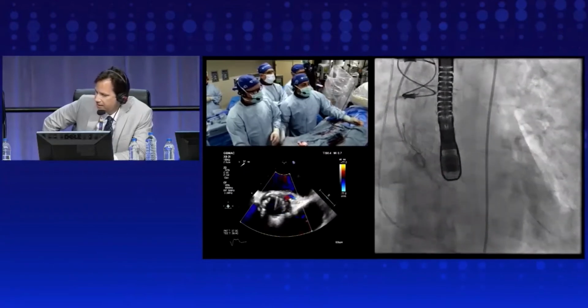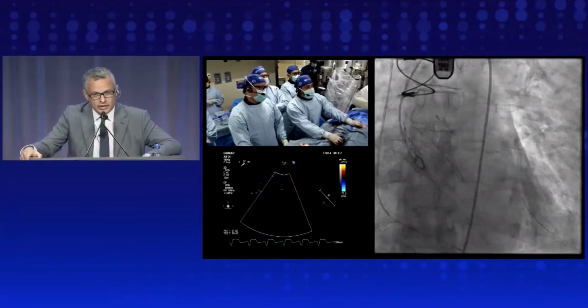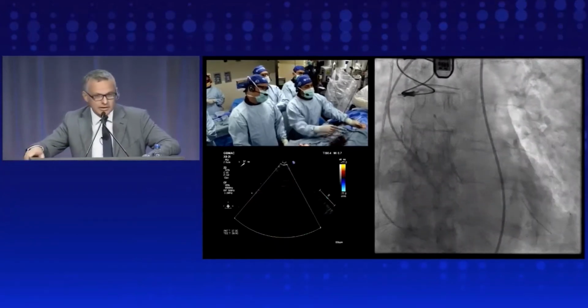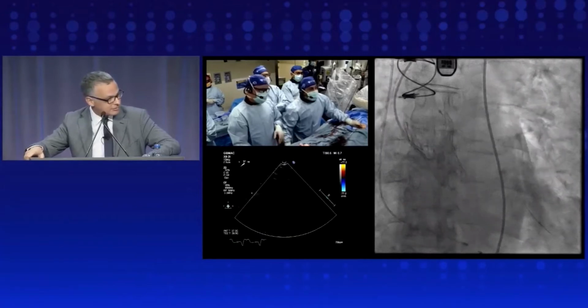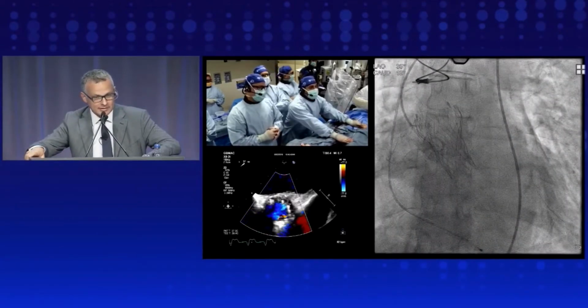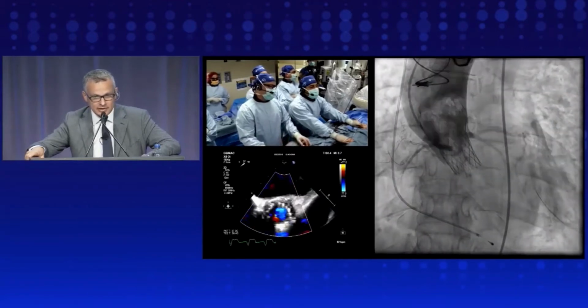Pull your Pro back, please. Pro back a little bit. So what is interesting here, echo shows very nice left main flow, but we don't see very well on angio. So it's good to have echo today. You see the echo there? Yeah, echo is good. Angio, right, okay, it comes now.